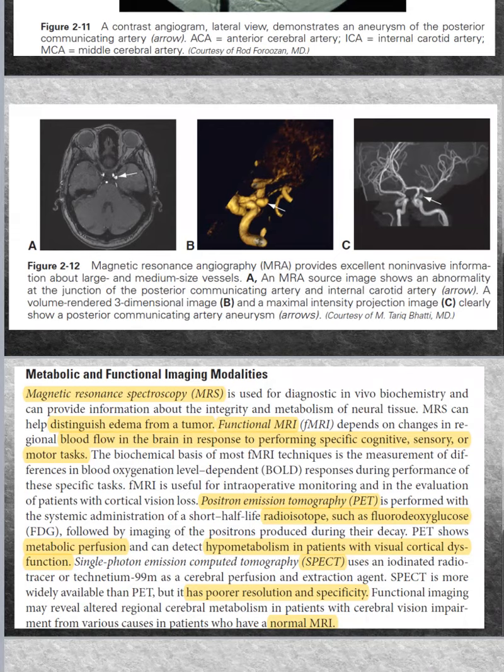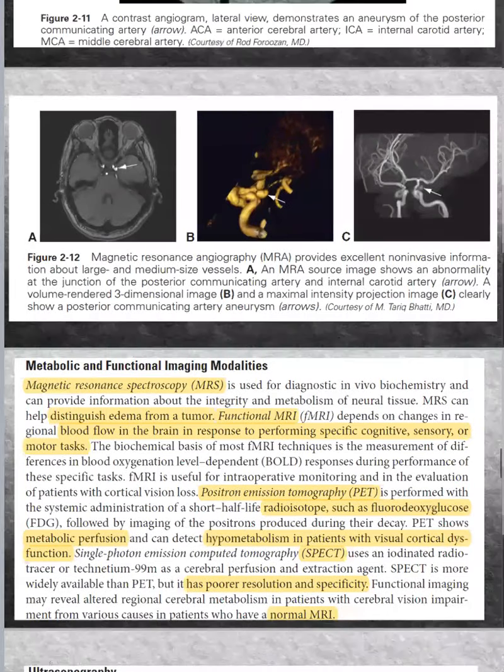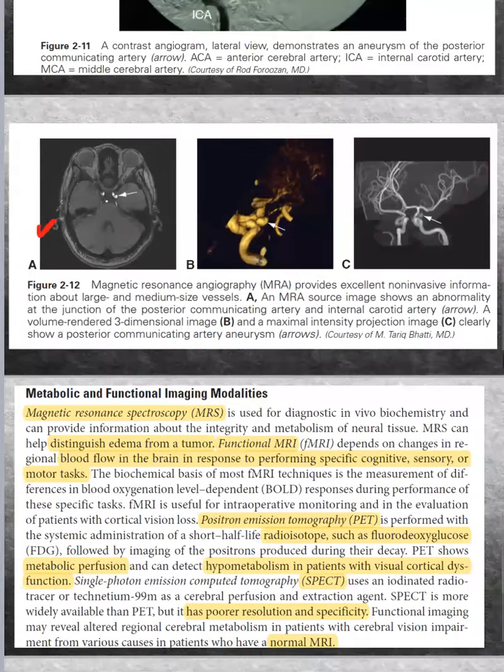Here it is the pituitary or the Turkish saddle, the sphenoidal bone, the sella turcica. And here you can say that this is the internal carotid artery. If you can see any aneurysm in this area, this means that you have a posterior communicating artery aneurysm. So this is the same lesion, but this view we are oriented with more than this and more than this, of course.